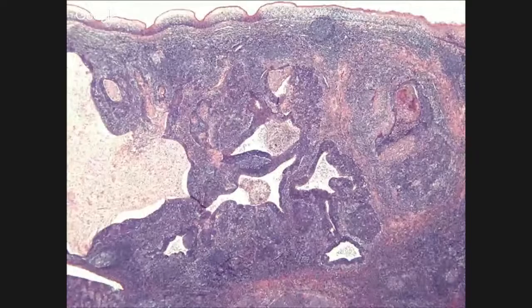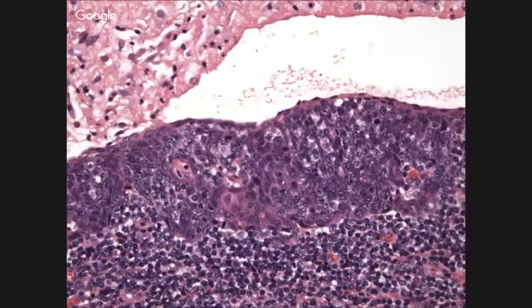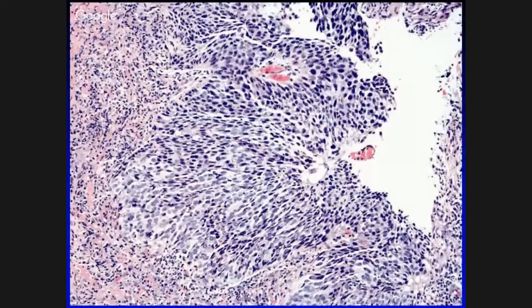Another example, just showing you that these cancers arise in the tonsillar crypt epithelium and not in the surface. So if you look at this, here's the cancer. If the biopsy, let's say a patient has a neck mass, no known primary, multiple endoscopic biopsies, if they only go to this level here, they don't see the cancer because it's sitting in the crypt epithelium. And here's the malignant epithelium, P16 positive.